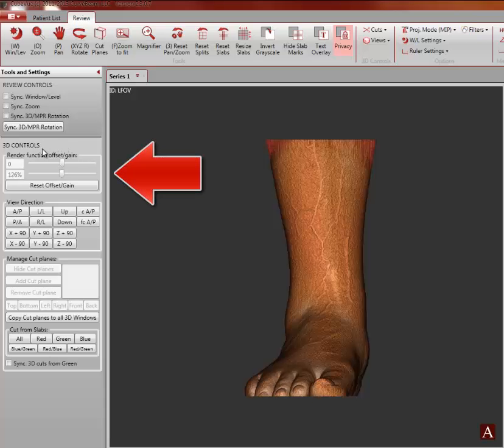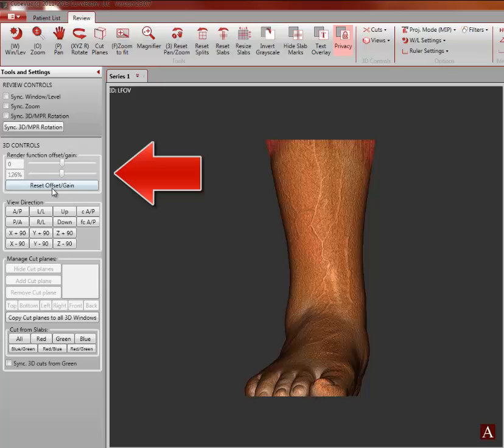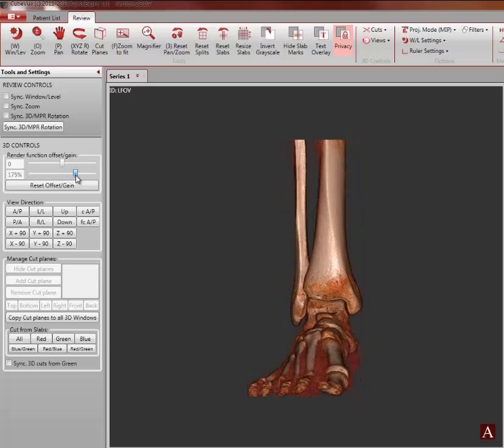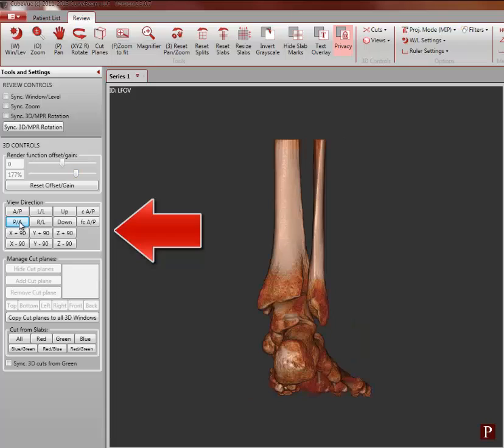One of the basic 3D tools is the thresholding render function. This tool allows you to add or remove skin and bone on the entire 3D rendering. Drag this scroll bar to the right to remove skin and reveal the bone.